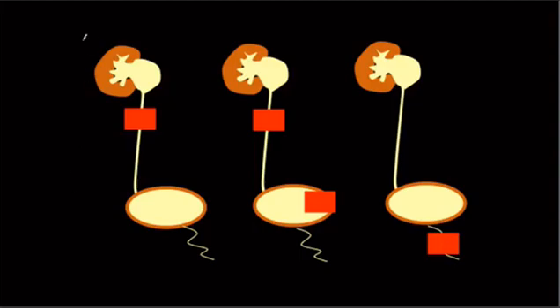All right, let's go through the first scenario. So normal bladder, normal distal ureter, normal urethra, but he's got fibrosis or stricture or stones or something here. The ideal scenario would be to give him a double J ureteral stent. Depending on the way the question is written, you could say that you would leave a safety in for 24 to 48 hours to make sure that this is working correctly. Some newer literature is suggesting maybe you don't even need that, but when I trained, everybody pretty much did that.